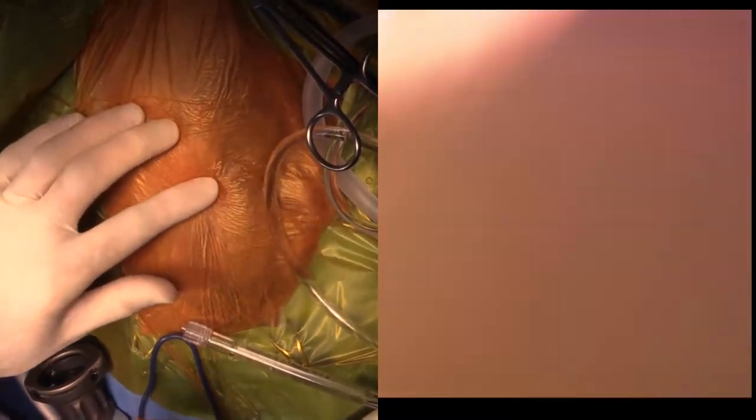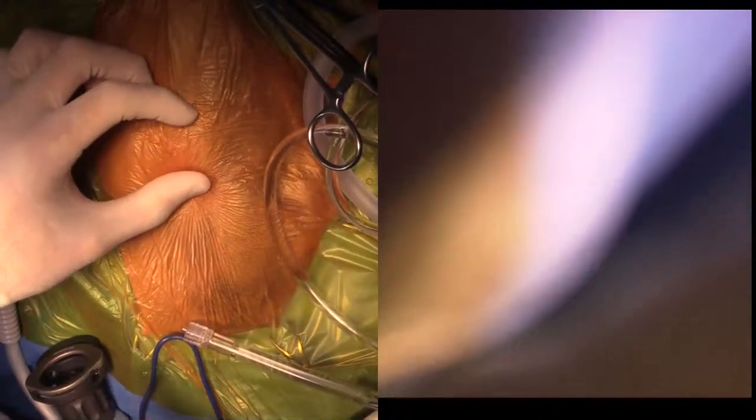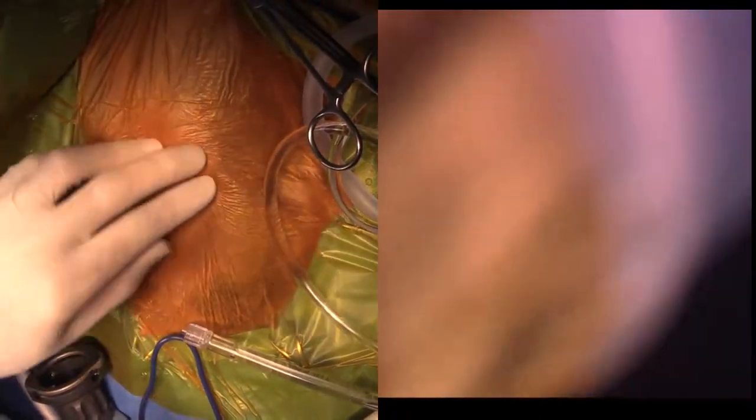I'm doing a shoulder scope in a dog with a right forelimb lameness and possibly a medial shoulder ligament replacement. Looking at the shoulder right here, I have my finger at the tip of the acromion. I do things a little differently — I don't hang the leg normally. I have it on a Mayo stand with the leg distracted, so the joint space should be quite wide.